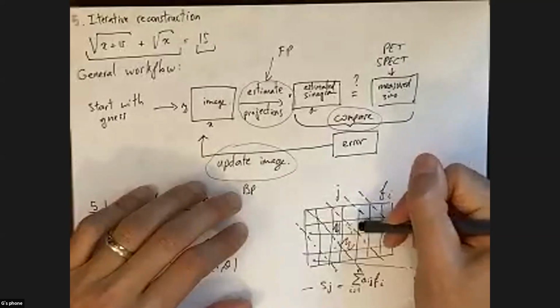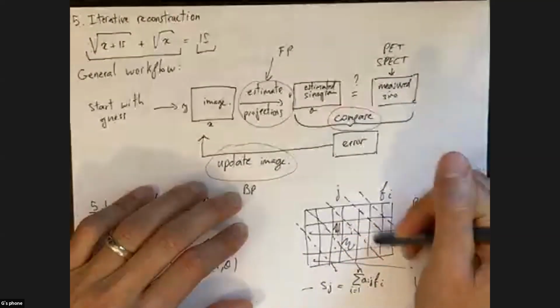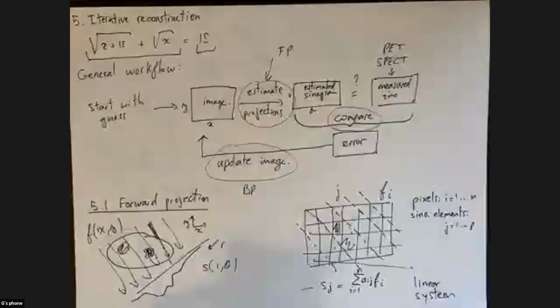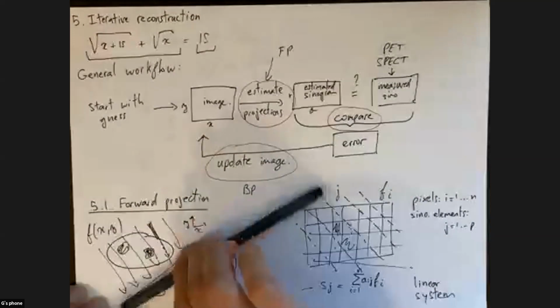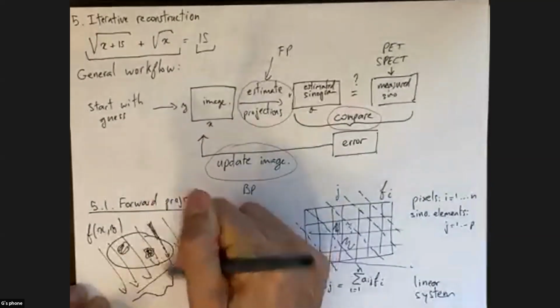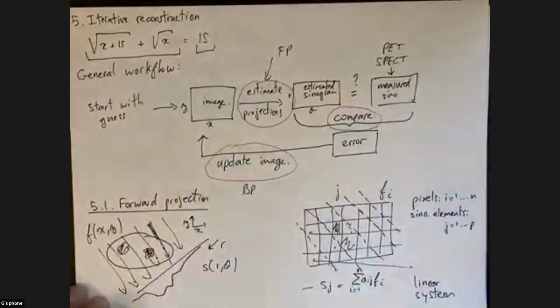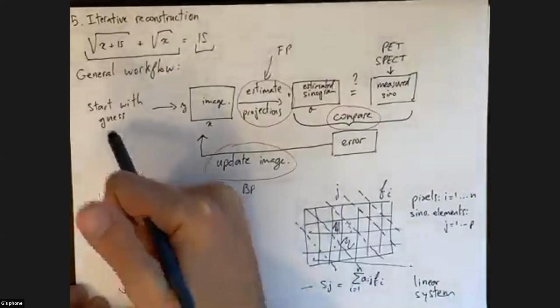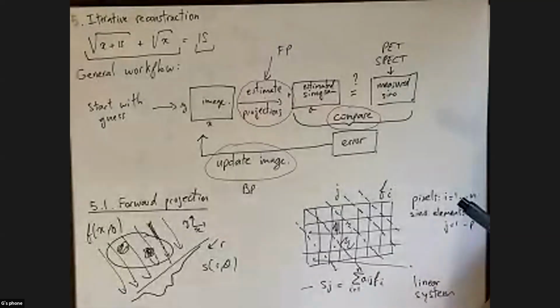And then for each pixel that's intersected by the ray, we're basically doing that. The goal is, if we have a projection, so this would be the projection here, to take this projection and smear it across, essentially drawing the values of the projection into the image. You can think about it like having a paintbrush and painting that pattern all across the image. I'll show examples using MATLAB, and hopefully this will become more clear.